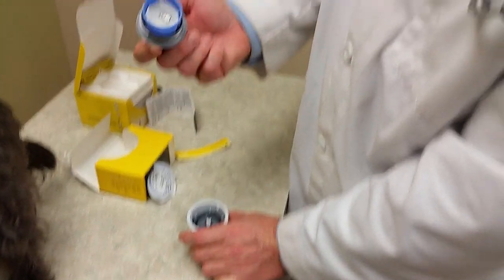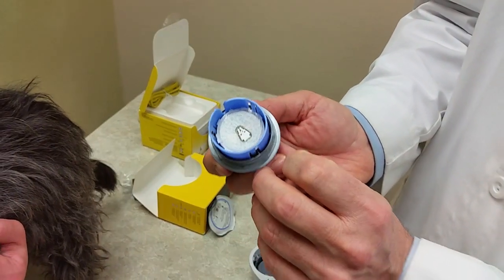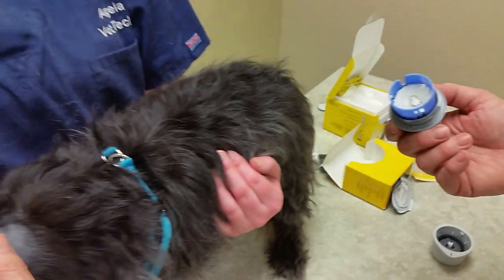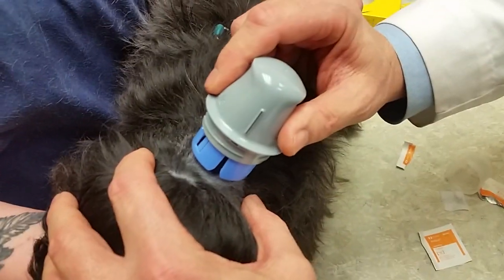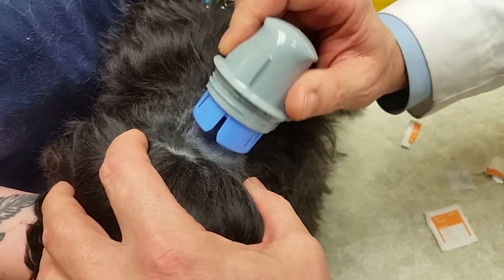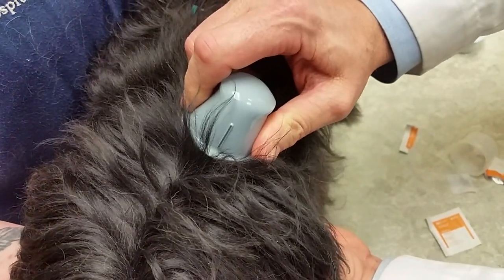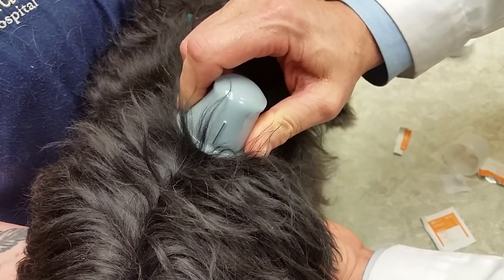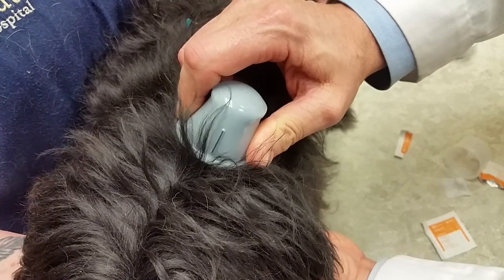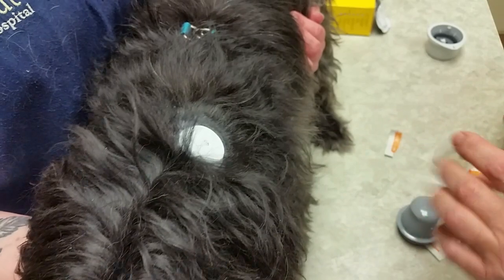When I pull this out you can see the disc with a little needle and the catheter. I'm going to come back here and put this right at the bare skin, push down, and hold it for about seven to ten seconds to let the adhesive stick. Then I pull that off and the disc is firmly attached.